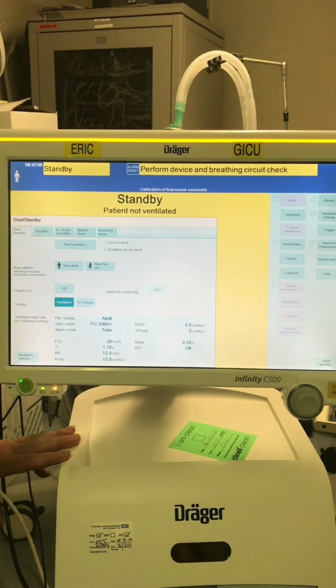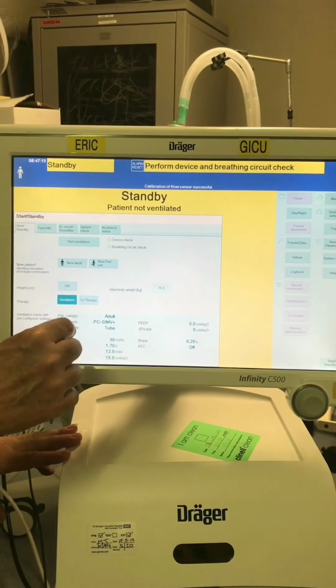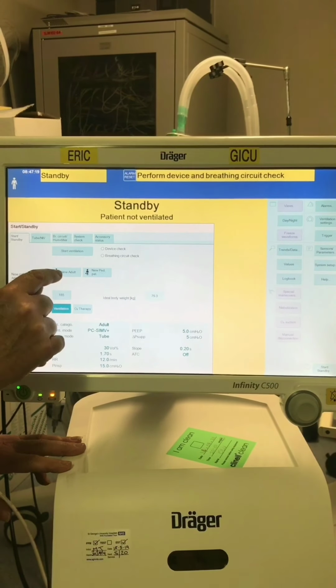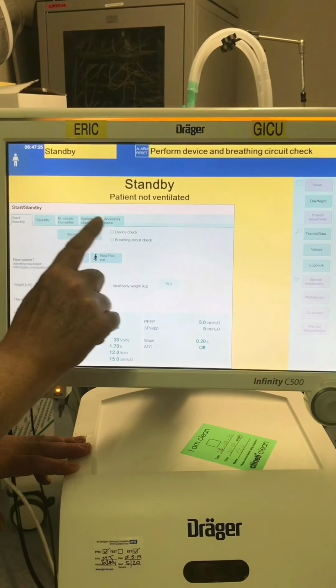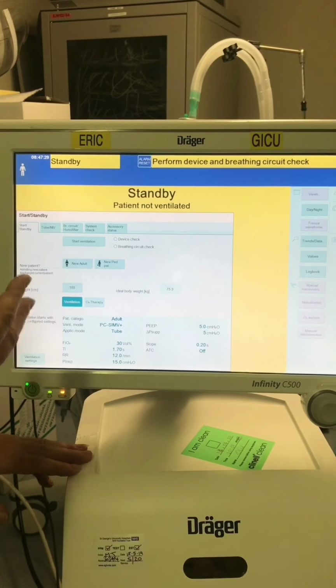If, however, it hasn't been turned off, this is the screen that you will see. It will be sitting turned on in standby. If it is in standby, then you'd have to tell it you want a new adult from this screen. What I'm going to do now is use these tabs here to go across and perform my device check and just check that it's set up correctly.